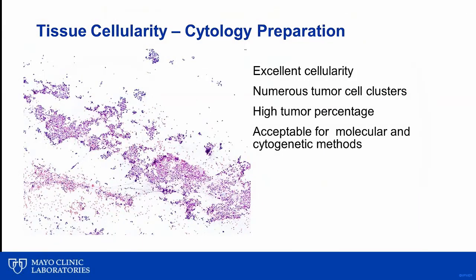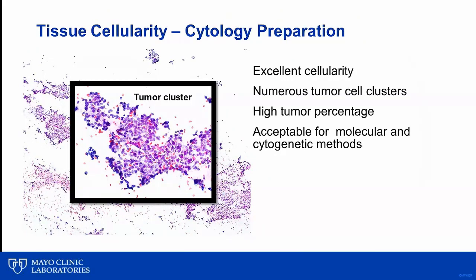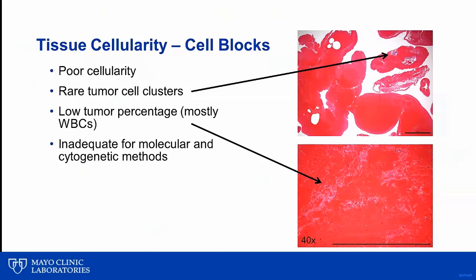Cytology preparations should be evaluated for the same metrics. This particular smear has excellent cellularity and numerous tumor cell clusters resulting in a high percentage of tumor nuclei, and this would be acceptable for most methods. In comparison, this cell block has very poor cellularity — the bulk of what we are seeing is simply red blood cells, and of the nucleated cells present, the vast majority are white blood cells with only very rare tumor cells. So not only do you have low cellularity overall, but also a low tumor percent, making this specimen inadequate for molecular and cytogenetic methods.